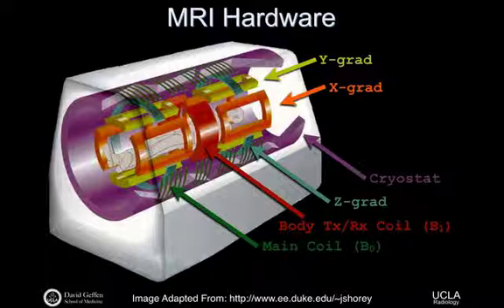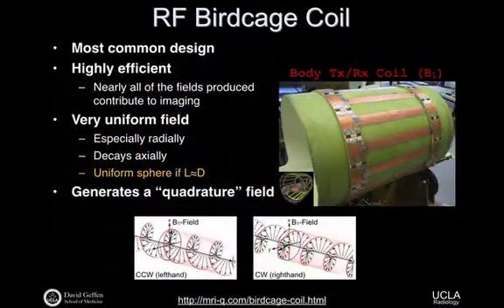It's also located concentric about isocenter, right? We know our B0 field is best and most uniform at isocenter. Our B1 system is designed to operate specifically in and around isocenter as well. This B1 system is not way down by your feet. It's not way up at your head. The anatomy of interest is advanced to isocenter because that's where the imaging conditions are most favorable. So we move your head to the middle of the scanner, your feet to the middle of the scanner.